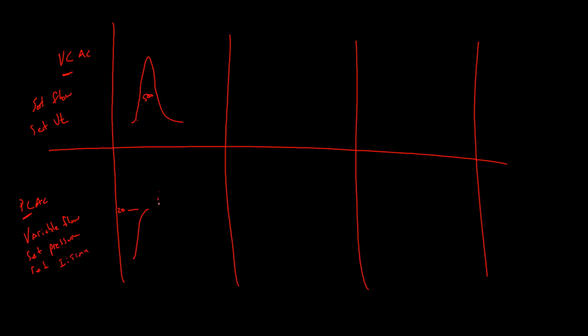Okay, so once it gets to that pressure, it will just hold it at that pressure until it gets to the I time, and then it will exhale.